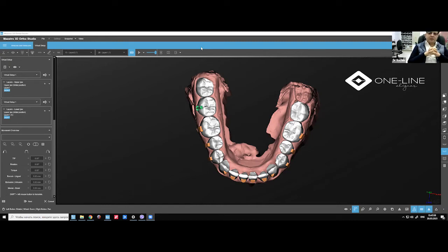Yes. Okay, so if I have understood the question right, the question is whether we can decrease the thickness on the posterior side, right? Yes. So if you want less posterior thickness, an easier way is to make the model on the posterior a little bigger, the base bigger. So when you thermoform, your sheet on the posterior will be thinner. You can have a base like this: the posterior is bigger and the anterior is smaller. So when you do thermoforming, the posterior thickness will be less, but there is no control. So sometimes you might have 0.5, 0.6.